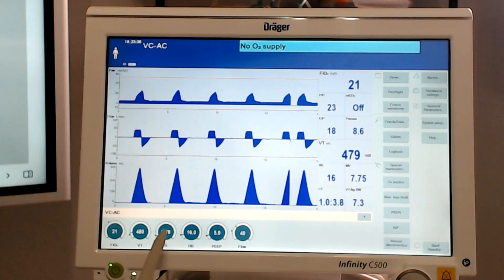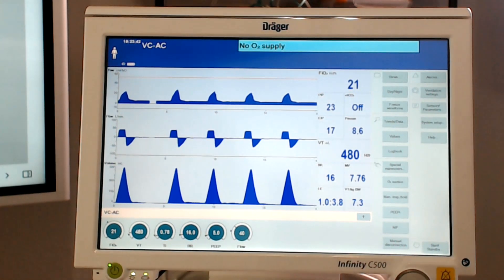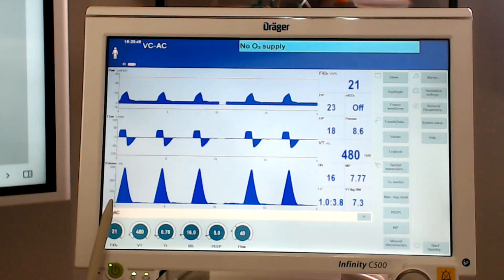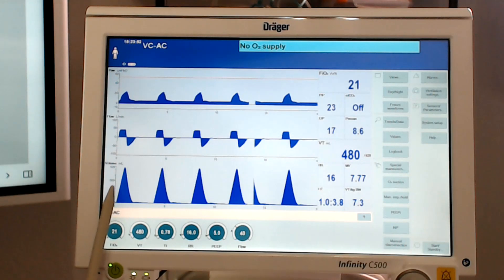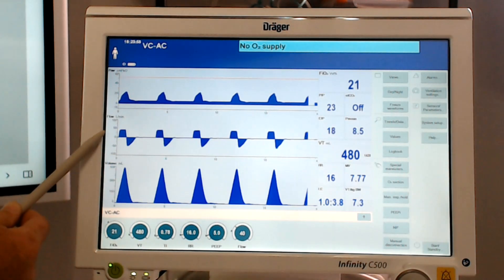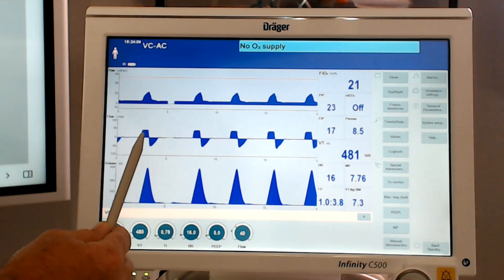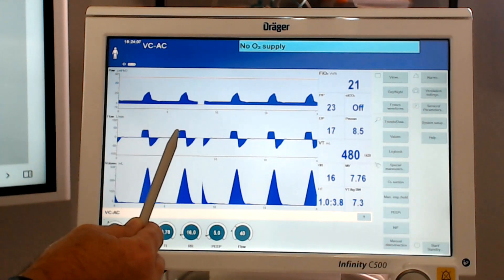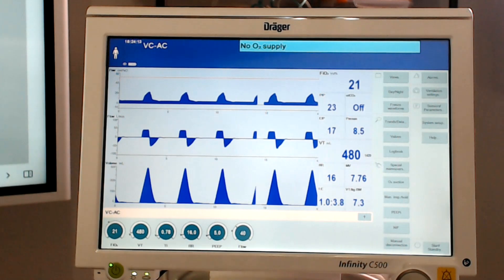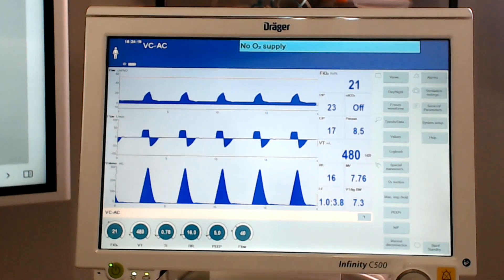Now we can change this inspiratory time — we can make it longer or shorter. Making it longer would add an inspiratory pause, but we'll talk about that in another video. For right now, I just want you to recognize that we are set on 480 mLs. Our volume waveform shows that volume is coming up just under the 500 mark and then falls back to baseline. When we look at our flow waveform, we see that we have a square pattern on the inspiratory phase — a square flow pattern happening during all inspiratory phases. This is also known as a constant flow pattern. You may hear it called square waveform or constant flow waveform — they mean the same thing.